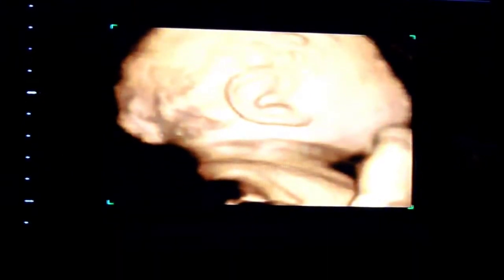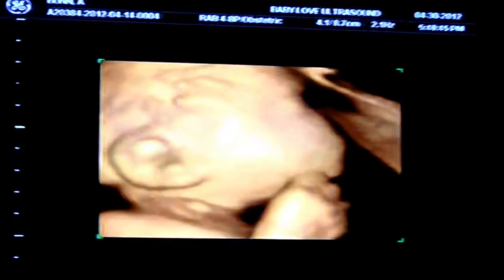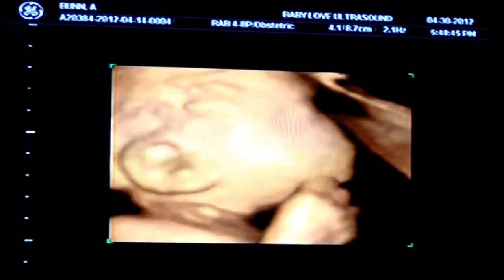That's all hair. She looks like Grandpa John. I think that is a detached lobe. Attached? Do you have it attached? I do. Is that going around her throat? That's going right there. Wrapped around her? I think it's just going over the one side. It's fine, it's not coming out the other side. It's just going over the shoulder. Frankie says relax.